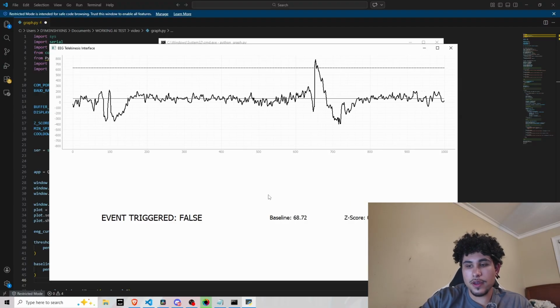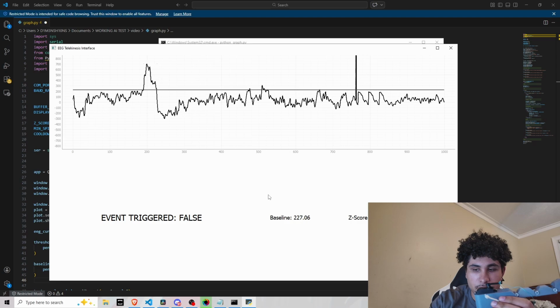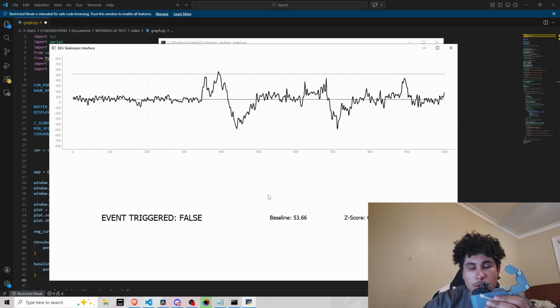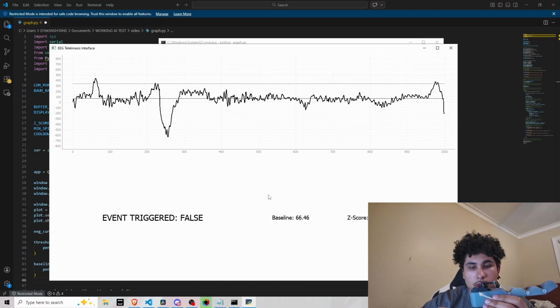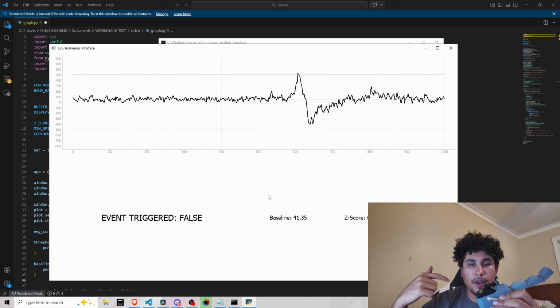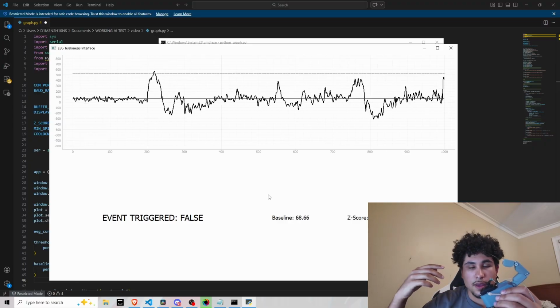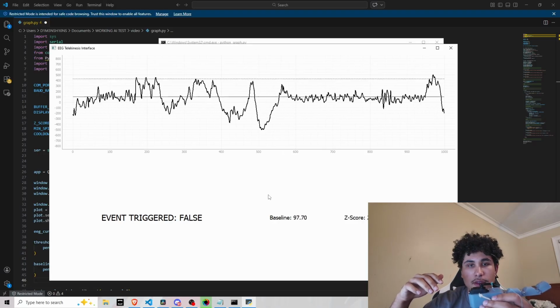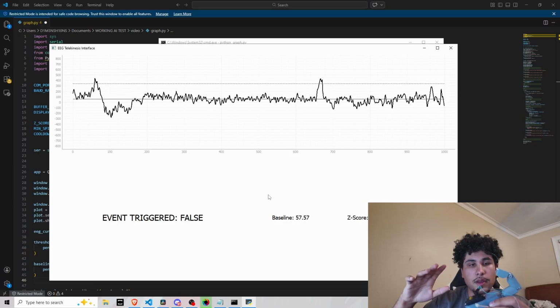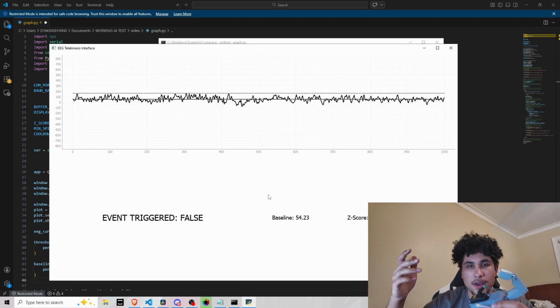So let's do a live demonstration. Once I plug this finger in, it should close at first, simply just because I'm talking. So let me zone out. Open. And then close. So it works somewhat well, but as you can see, now that I'm talking a lot, it's going to malfunction. But if I zone out, close, it kind of works. So it's pretty 50-50. Zone out, open. So it works-ish, but not great, as you can see.